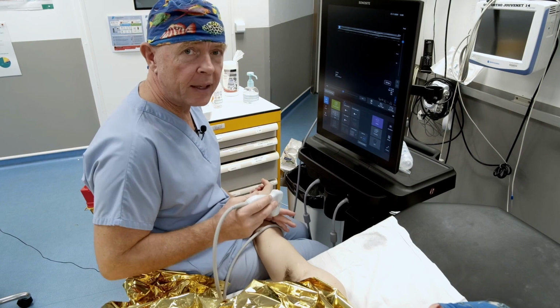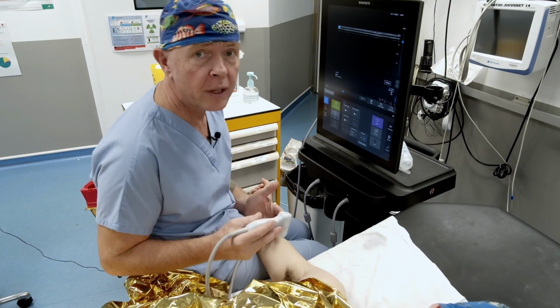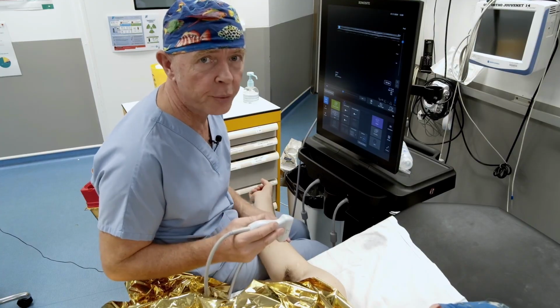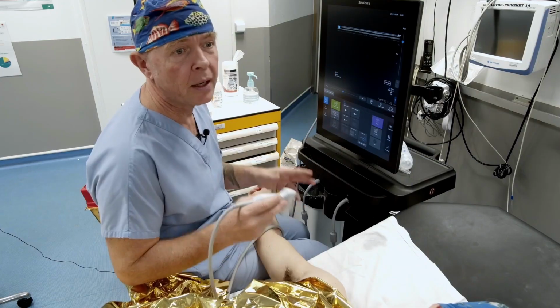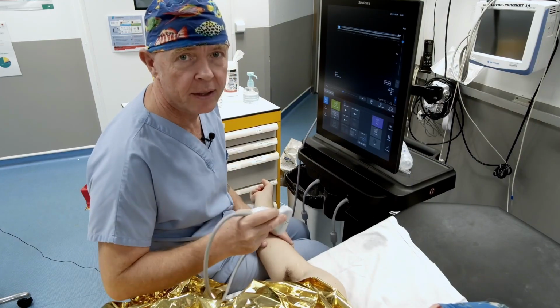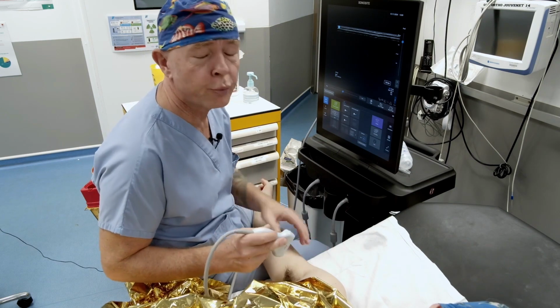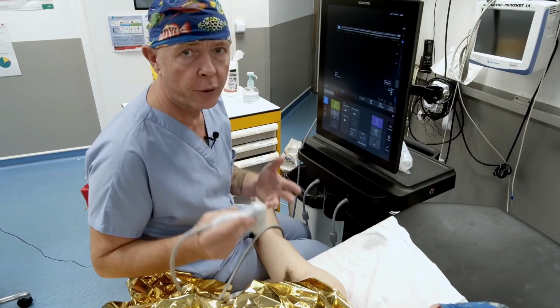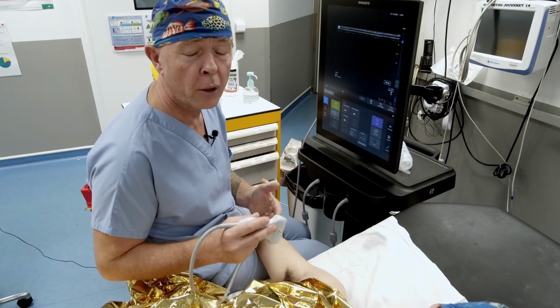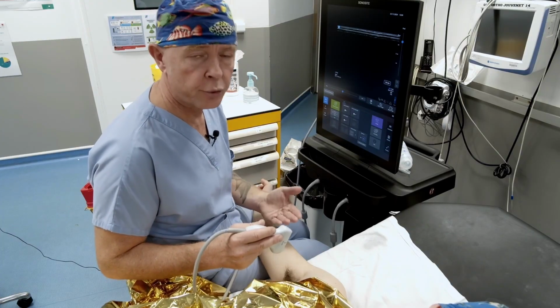Practical workshop number 4 therefore consists of aligning what we saw in workshop number 1, that is the elements of sono-anatomy, nerve recognition, including the structures and their dynamic characteristics, with ultrasound imaging, and step number 3, the choice of the puncture site and visualization of the needle. So here, of course, this is workshop number 4. We will review the different limbs, the various blocks of the upper limb, the lower limb, and then the diffusion blocks.